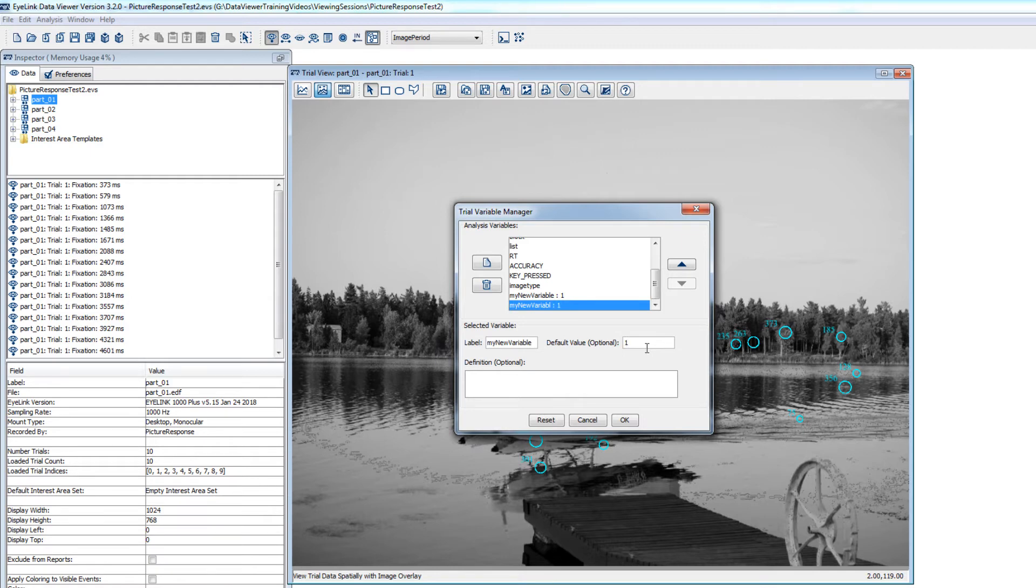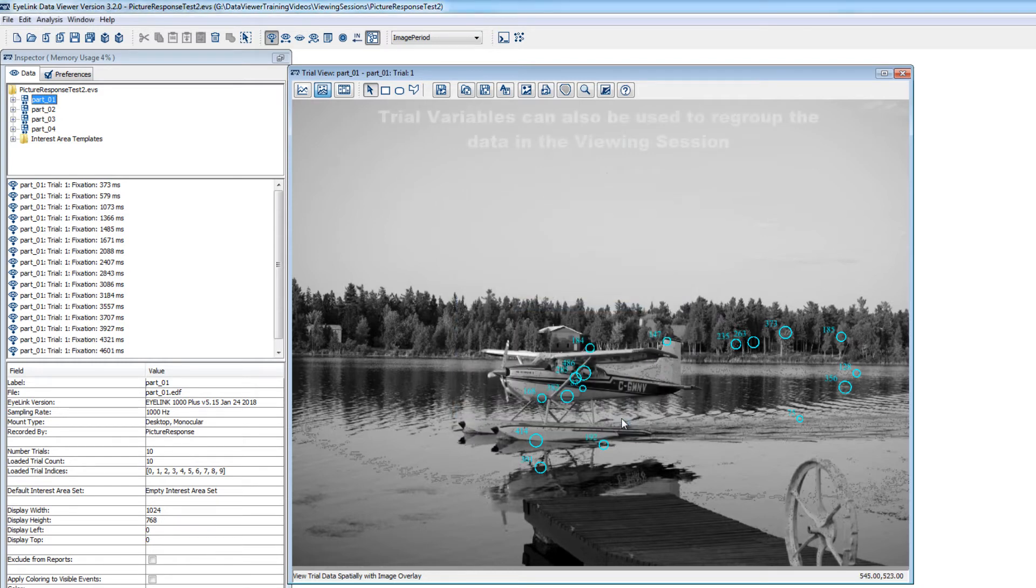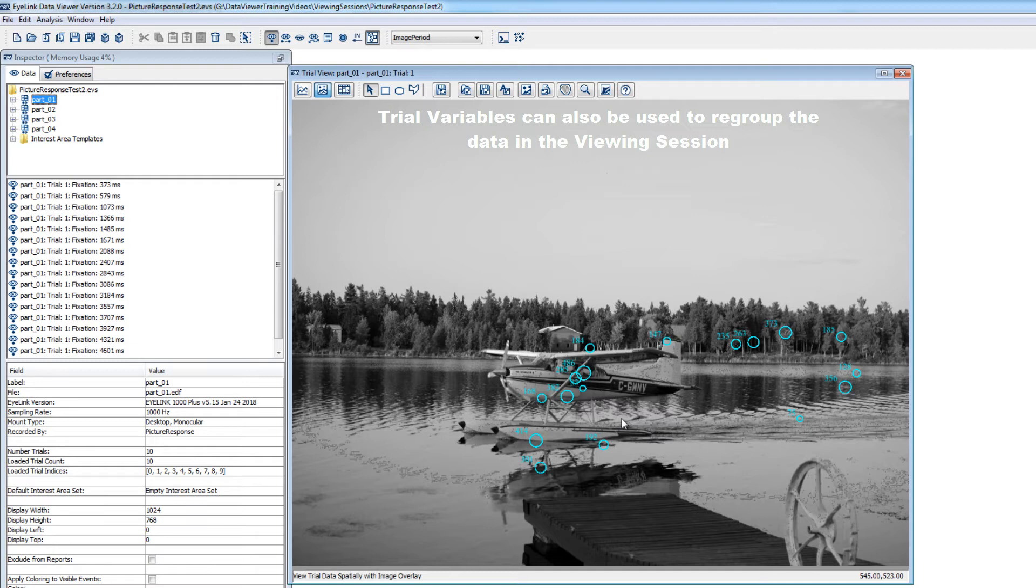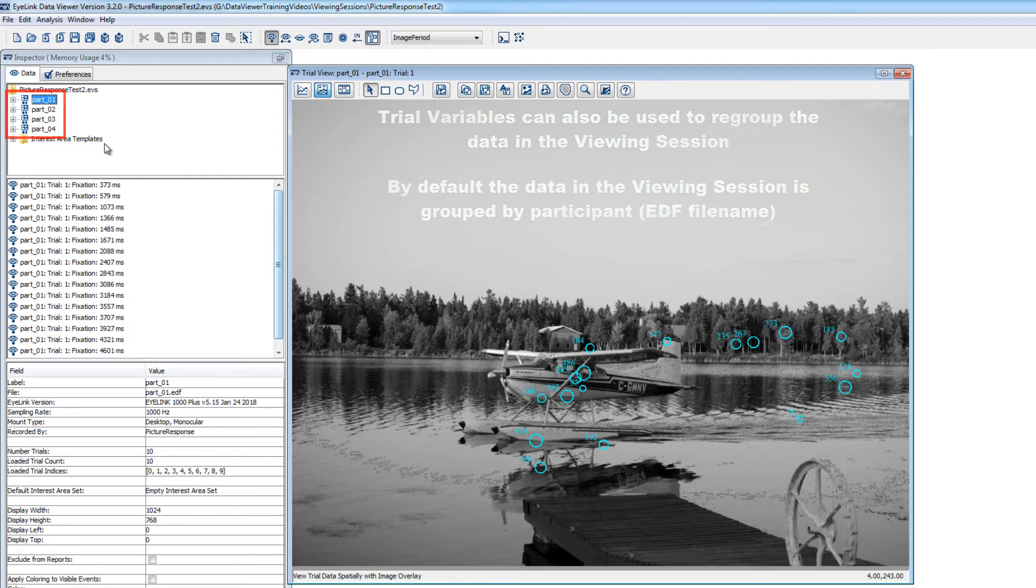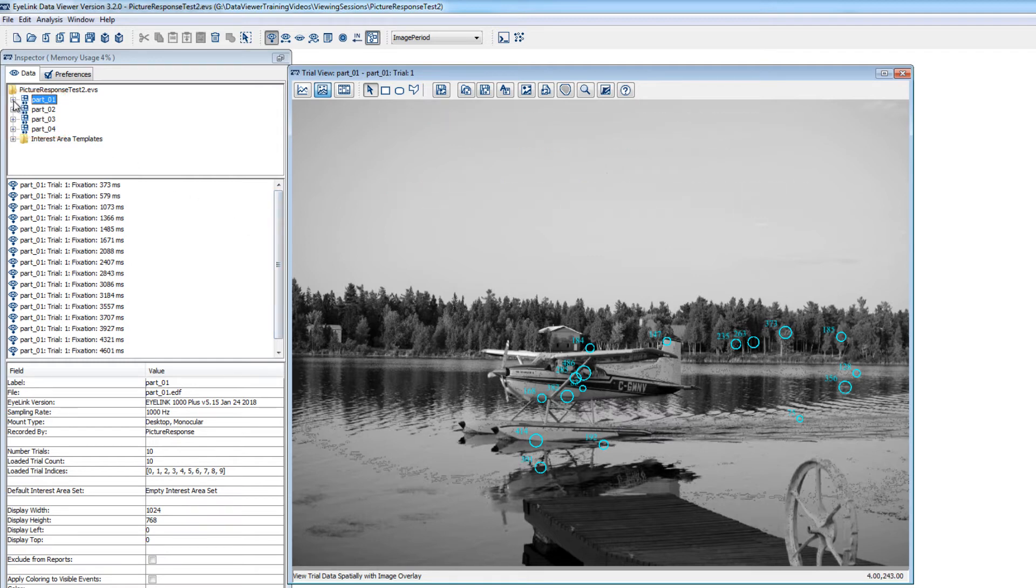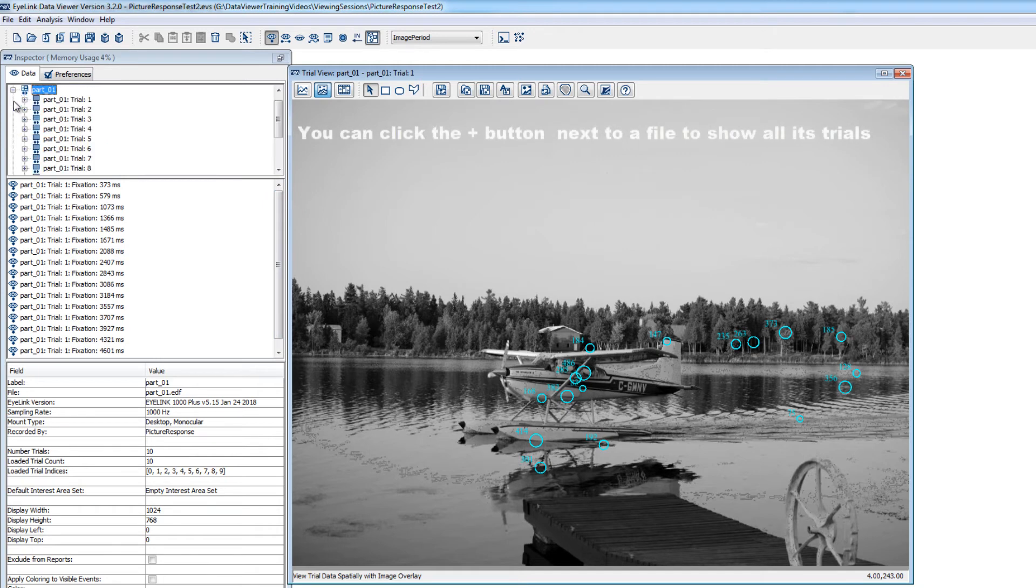Critically, trial variables can be used to regroup the data in the viewing session. By default, the data in the viewing session is organized by EDF file name, and you can see this organization in the Inspector under the Data tab. All the trials of a given EDF can be viewed by clicking the plus button next to an EDF file name to expand it.